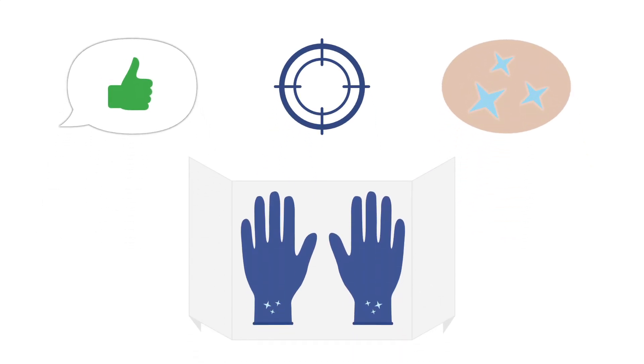Once you've obtained consent from the patient, mark the triangular joint space just medial to the patellar tendon with a vial cap and sterilize the skin. You can then put on your sterile gloves and proceed.